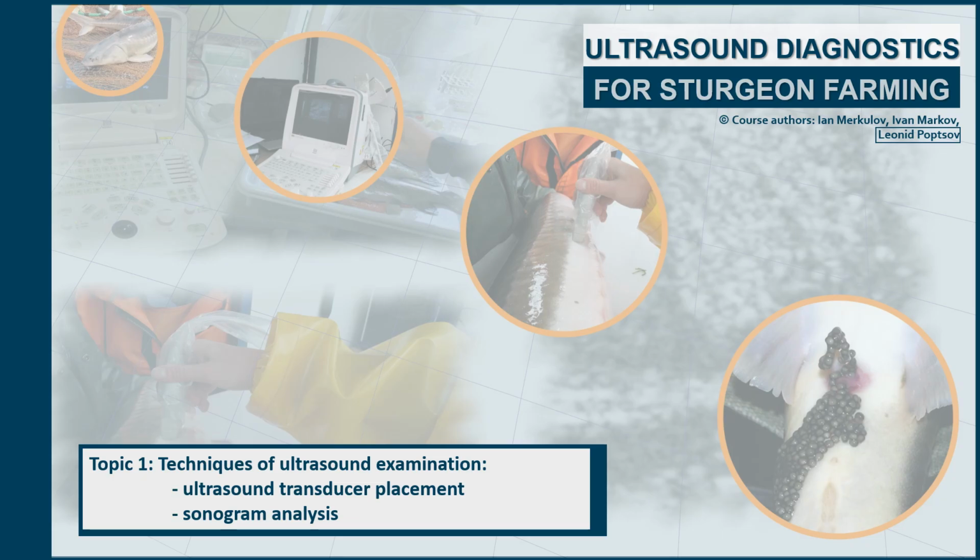Hello dear colleagues, we welcome all those interested in sturgeon breeding and rearing to the first part of the web-intensive course, Ultrasound Diagnostics of Sturgeon, which will be devoted to describing the basics of ultrasound examination techniques for sturgeon, in particular the technique of placing the transducer, choosing the location and the scanning plane, as well as the basic principles of sonogram analysis.